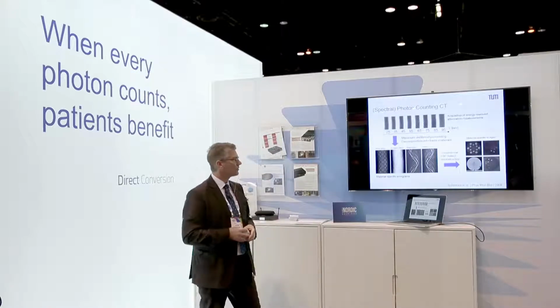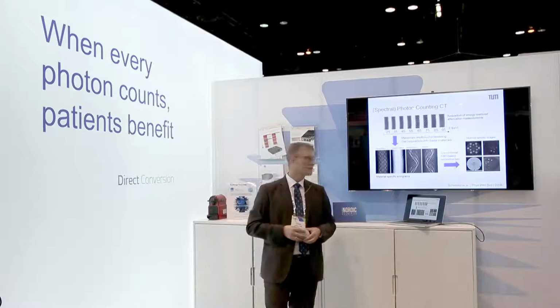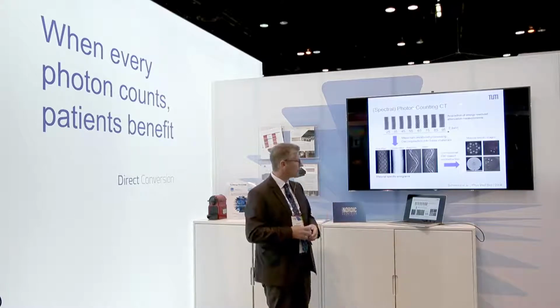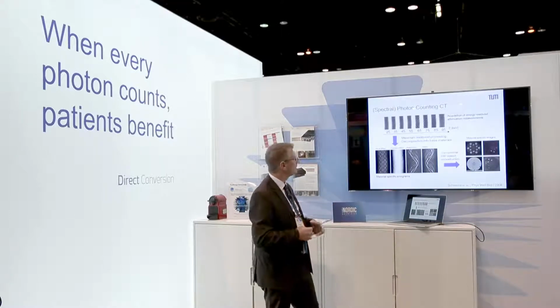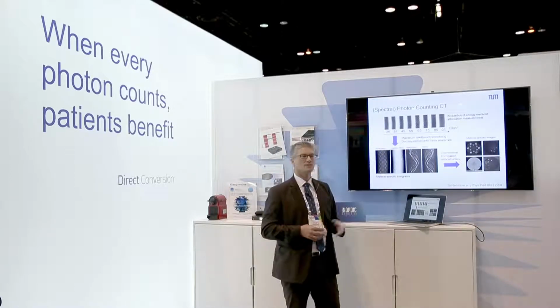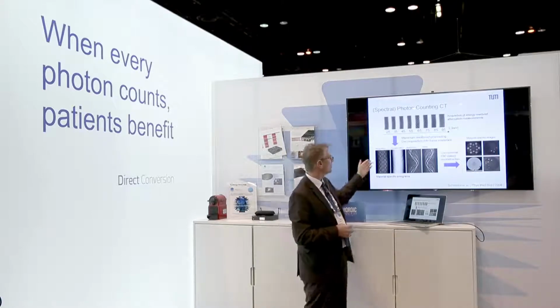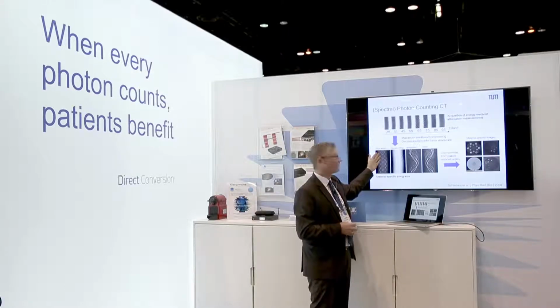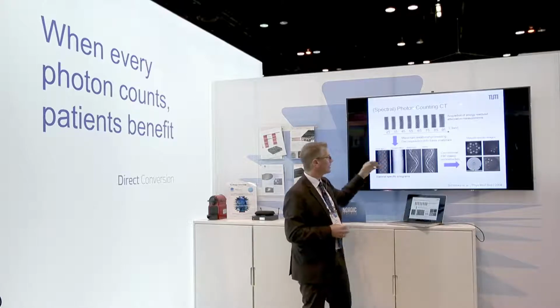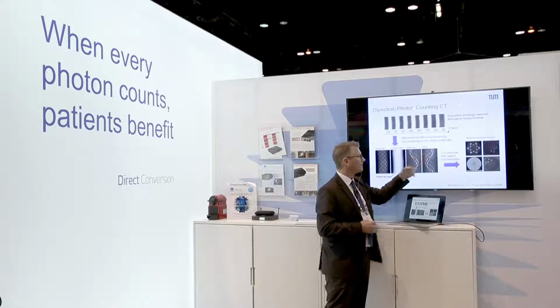Now, the approach would then be, and this is one of the first experimental demonstrations on a preclinical system done by Schlomka et al., it's actually from Philips here. You would measure the sinograms or projections at the number of bins you have available in your system, and then you calculate the photo effect from that, the Compton effect, and for example also the K-edge contribution of gadolinium if you have used that as a contrast agent, or iodine, for example.